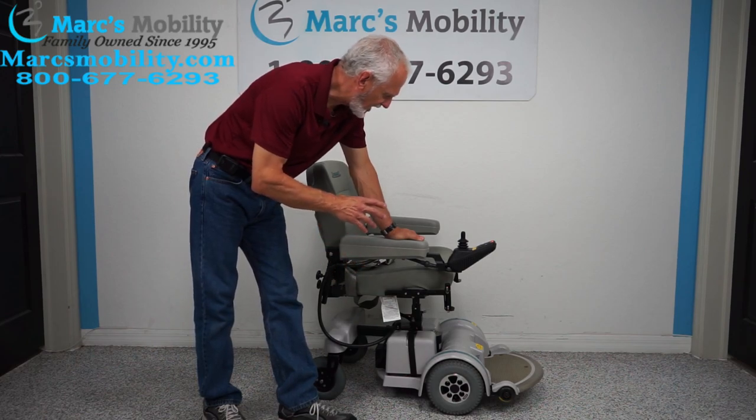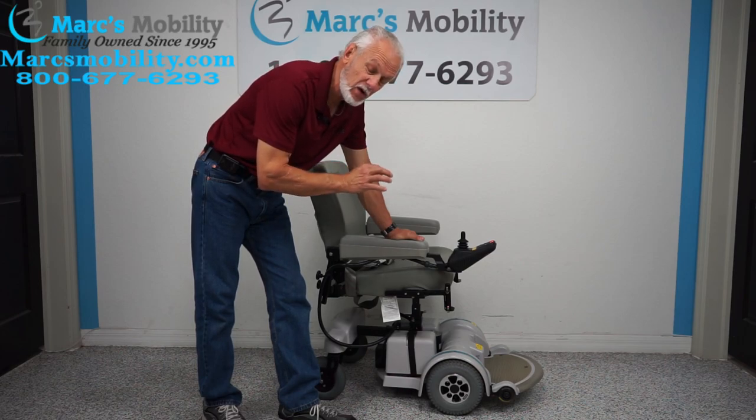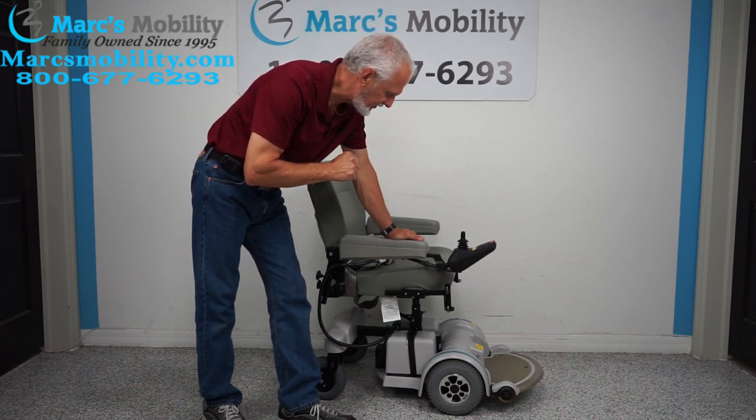We have here a one-of-a-kind — this is a Hoveraround MPV-5. This is the power chair, but this one has the five-inch seat lift. This is the Hoveraround MPV-5 with the five-inch seat lift.